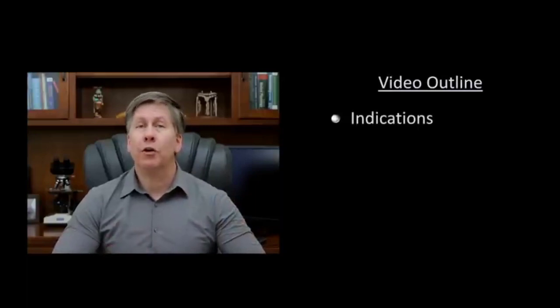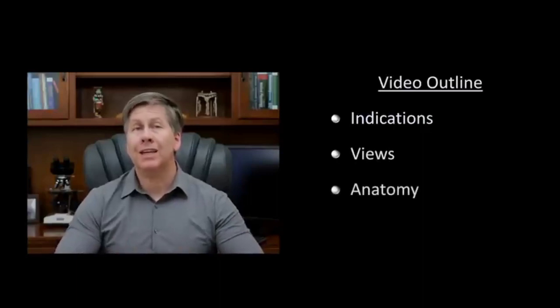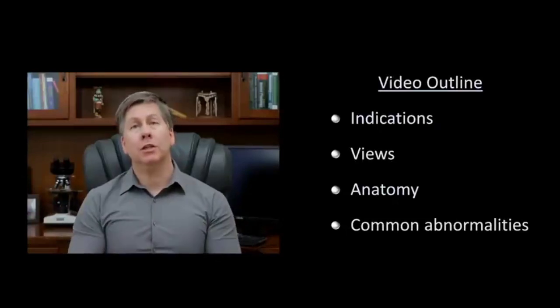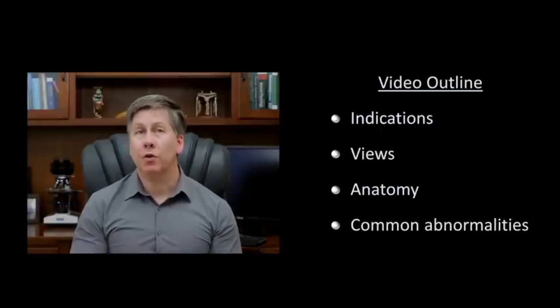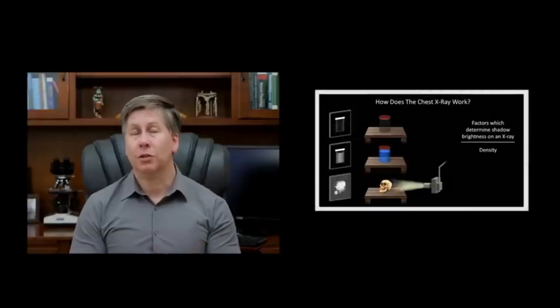The utility of the abdominal x-ray in today's practice, practically speaking, is very limited. With that being said, abdominal x-rays are still ordered relatively frequently in a few discrete clinical situations. And I've listed a couple of them here and the sensitivity of abdominal x-ray in these clinical situations. First, for ruling out free air, say in the setting of perforation, the abdominal x-ray is actually quite sensitive, but it's not 100% sensitive. In cases of suspected obstruction, the abdominal x-ray is actually not that sensitive.